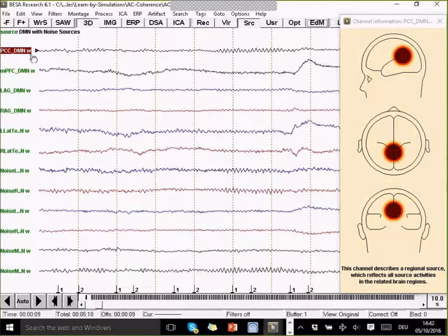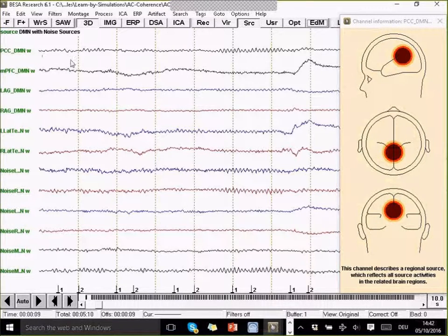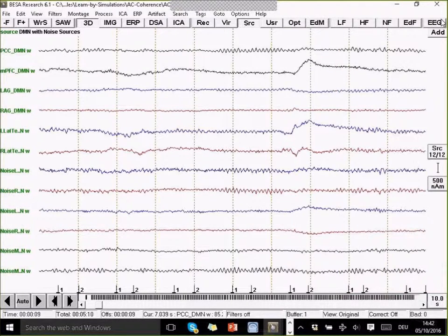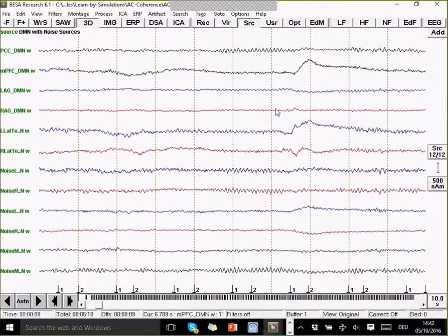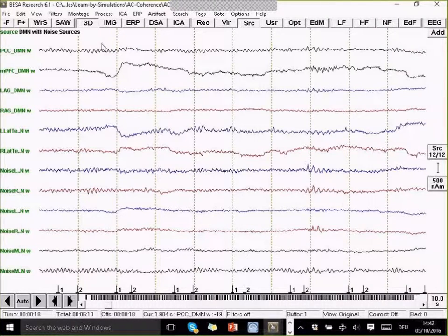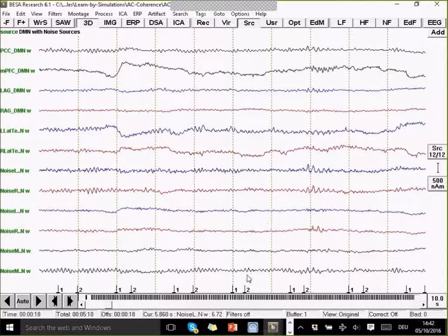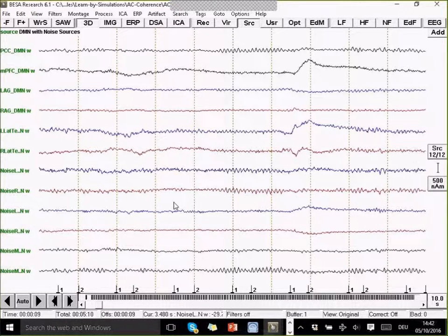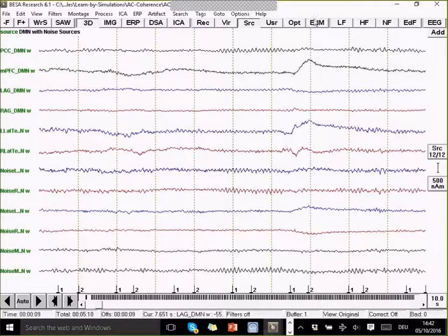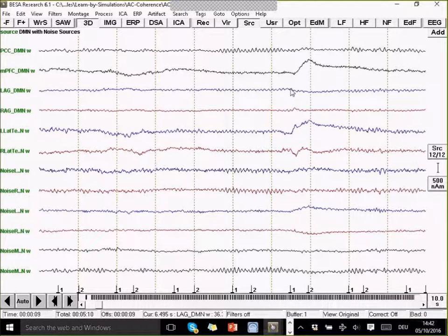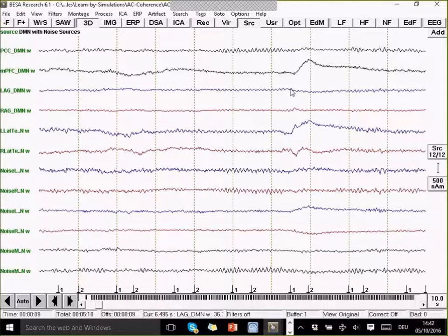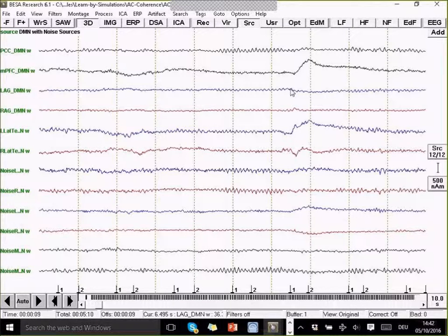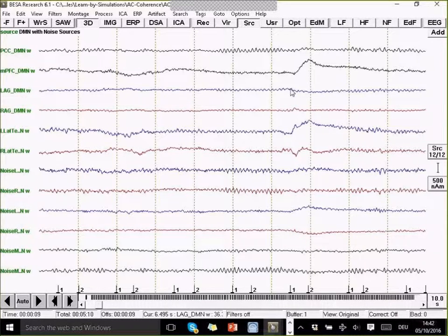This one, for example, is typical for alpha rhythm. And you can see already that it picks up a lot of alpha here. We can then, if you want to study this in time-frequency, create triggers at regular intervals and then use these trigger intervals for time-frequency decomposition and analyze coherence between the different sources, for example.